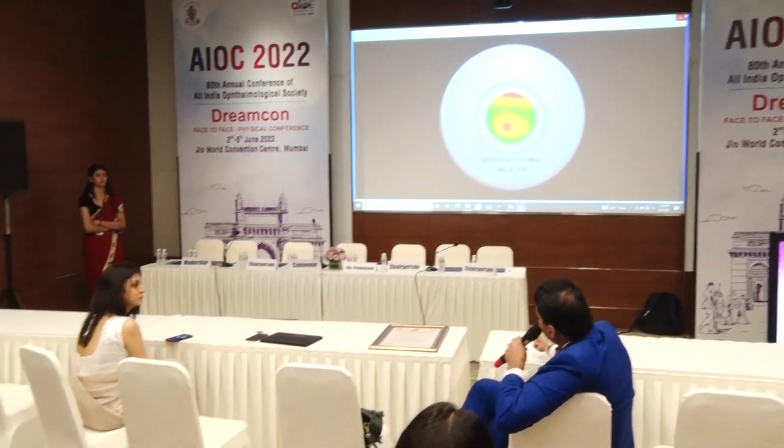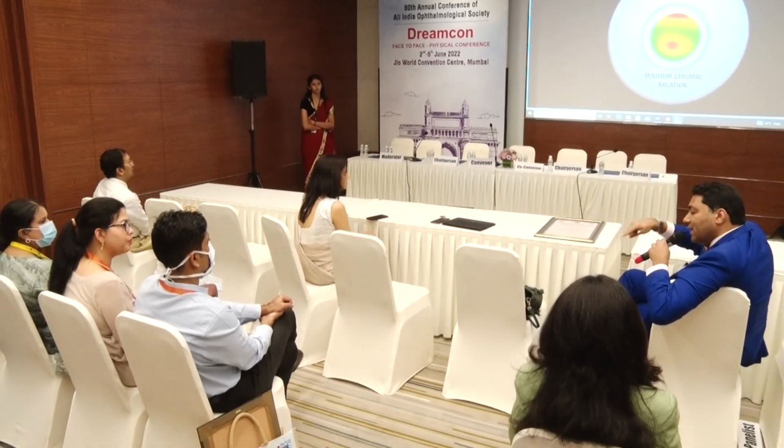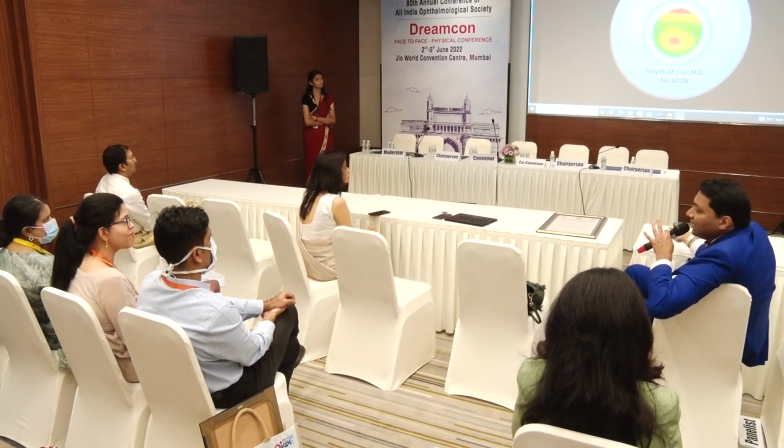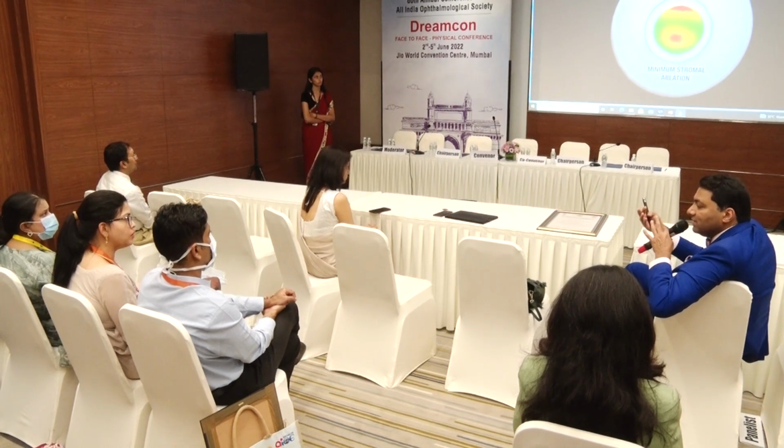No MMC. If you do MMC, it creates scarring. It actually creates more scarring. It's a different wound healing philosophy here, because there are no keratocytes here. Because there are no keratocytes here, the scarring is very minimal. If you put MMC, it cross-reacts with the cross-linking oxygen free radicals, and you create a challenge.